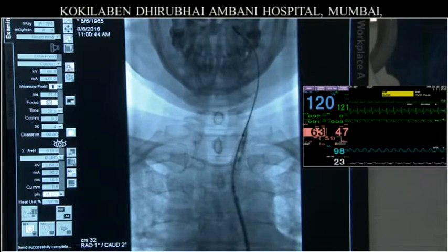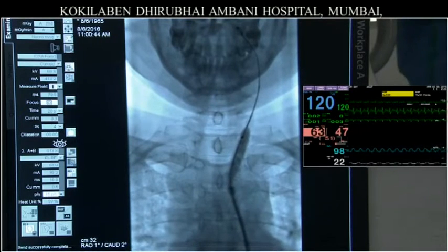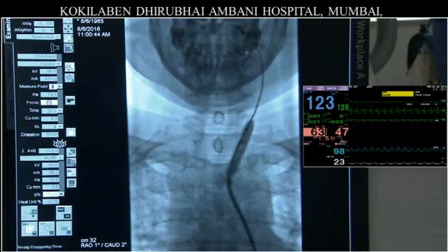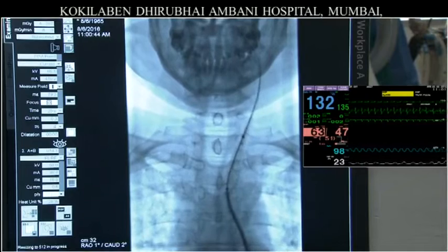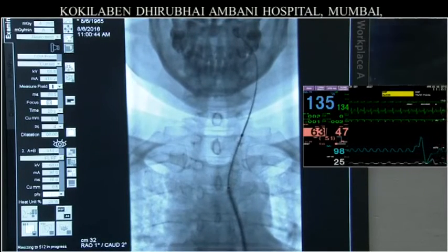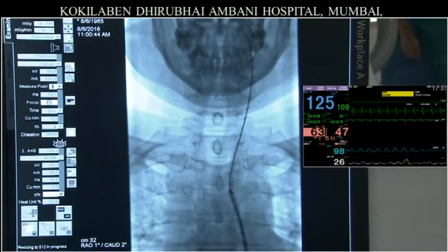And the plan was to do a TAVI, and the strategy was to try and land the valve sandwiched between the sinus. At the same time, filters in each carotid to make sure I'm going to catch it if it does go up. I could try it as many times as I want so that I can get it. We started off the implantation. I'm going to sandwich it, but then because of the lack of calcium, they do slip off, as you can see here.